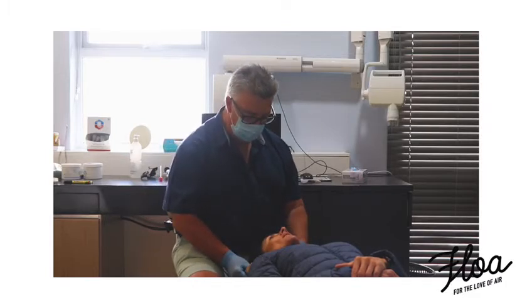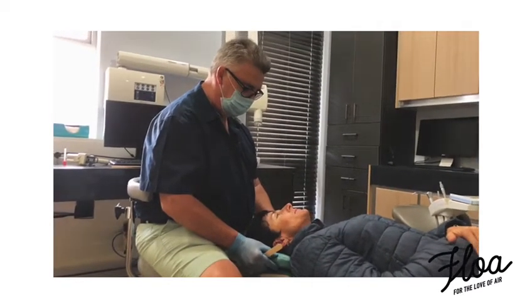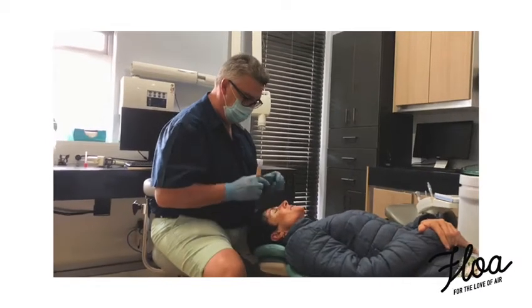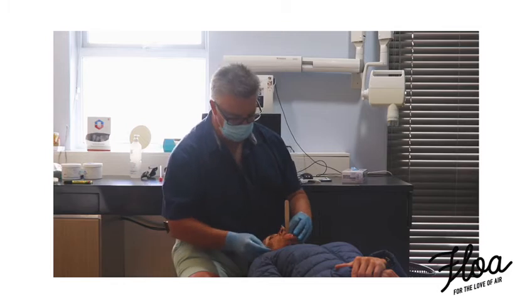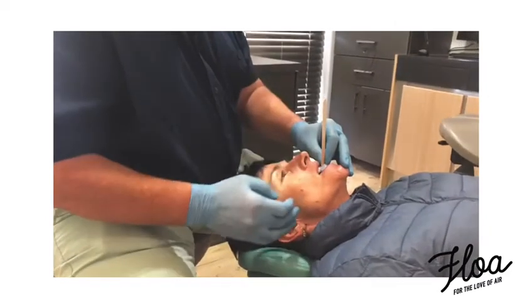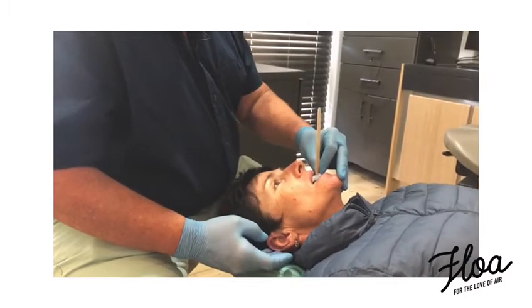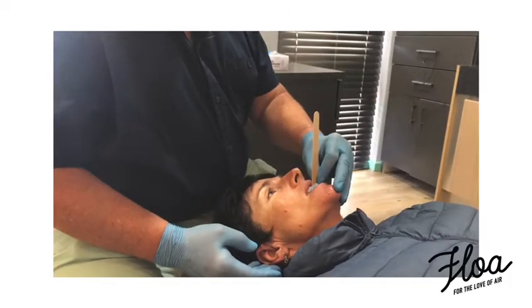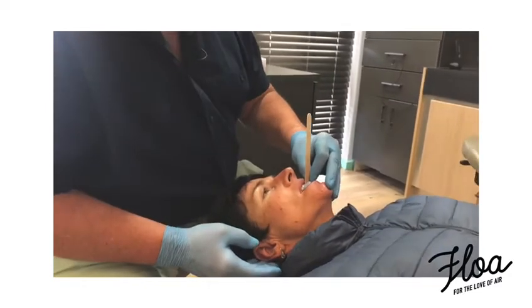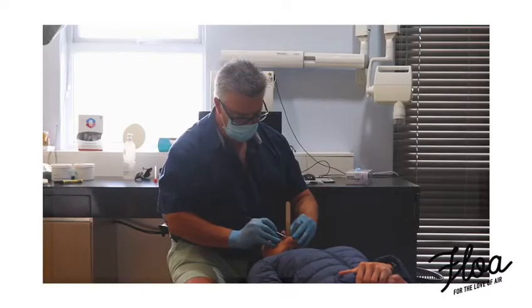Michelle, give us a nice snore — and again, a bit louder if you can. So now we're going to get our little stick in. I generally simply start with an edge-to-edge position. Leave a little bit forward with your mandible — remember to keep it parallel. Give us your snore again. It's already a little bit better. A little bit forward — give us a snore again. There we go, a little bit forward. Snore again. There we go. So now we mark our position.